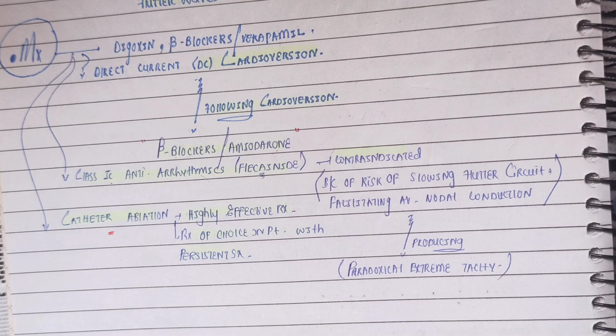An ectopic focus is present in the heart, especially around the tricuspid annulus. The firing rate is 300 per minute, creating large re-entry circuits and triggered activities. Right? Most of the time it is associated with AV block. And you will see on the ECG that something in the heart is firing at a rate of 300 per minute. It will produce lots of uncoordinated atrial contractions and lots of P waves, obviously, which you will see on the ECG as flutter waves, sawtooth waves, and sometimes they are so many that they are buried in the QRS complex or T wave.